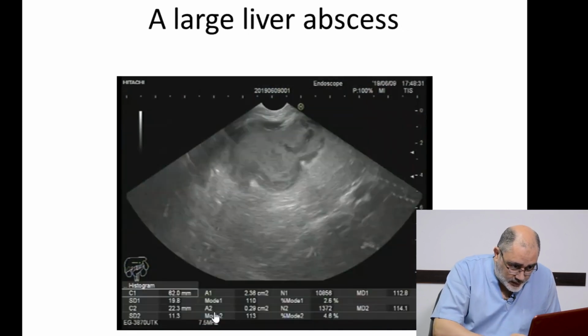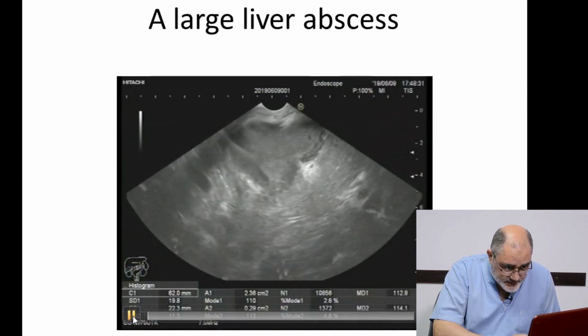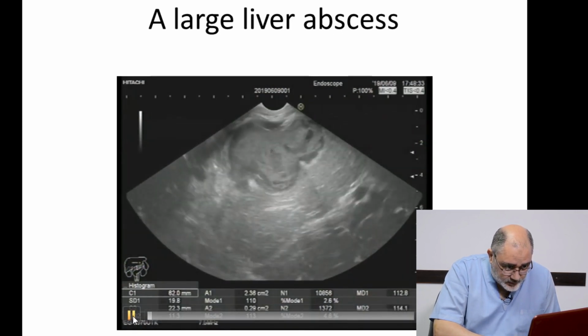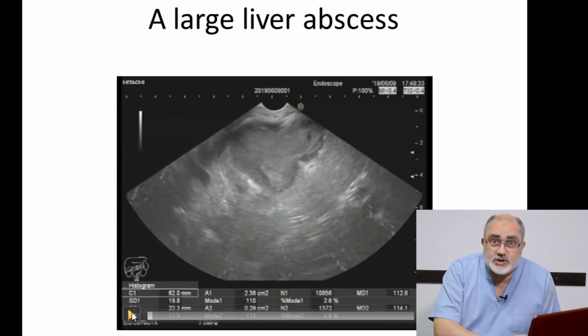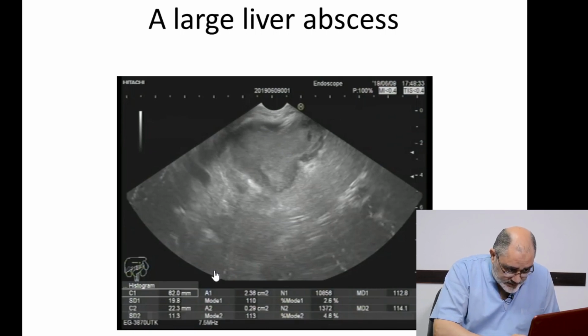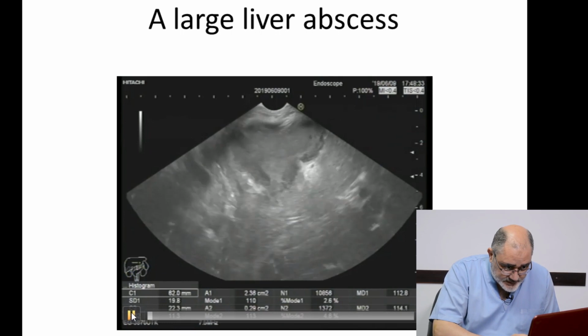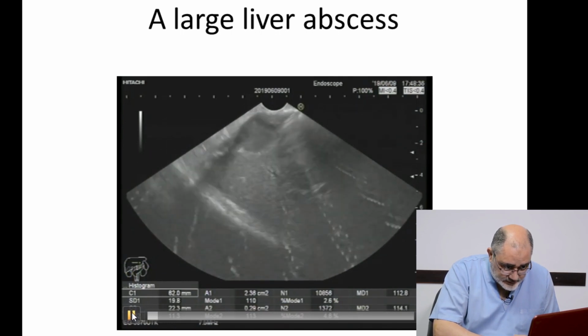Okay, let us see this large focal lesion, complex cystic, with soft tissue shadow inside and peripheral fluid. Looks like an abscess, and actually the patient has fever and rigors, so the most likely diagnosis is a liver abscess.